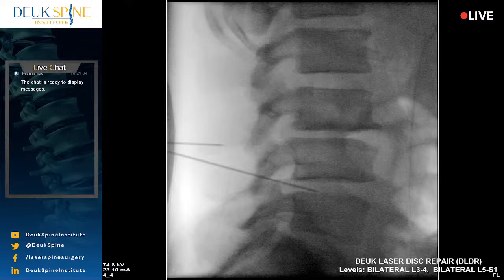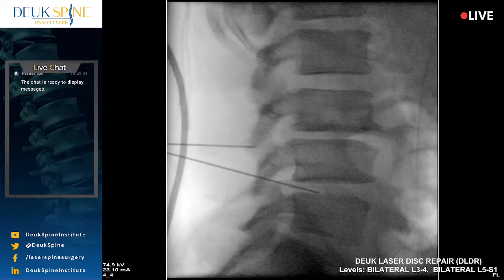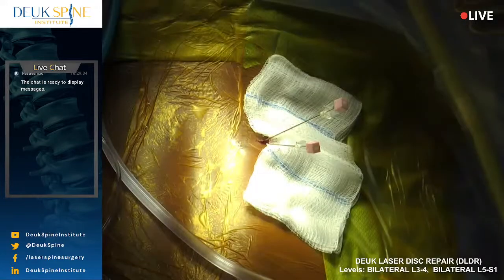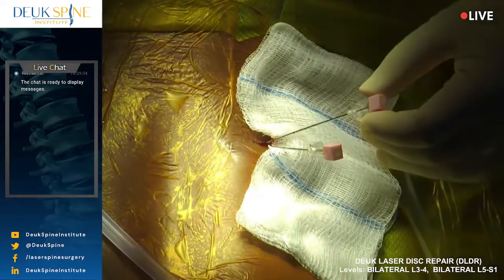Can we get the blood pressure down just a little bit if possible, doctor? Or you want to just wait till the propofol? Fine. Shot? That's fine. That's perfect. You can actually see the herniation on that x-ray. Oh, see the one down below is even bigger. Look at the herniation. Oh, yeah, the one down below is even bigger.